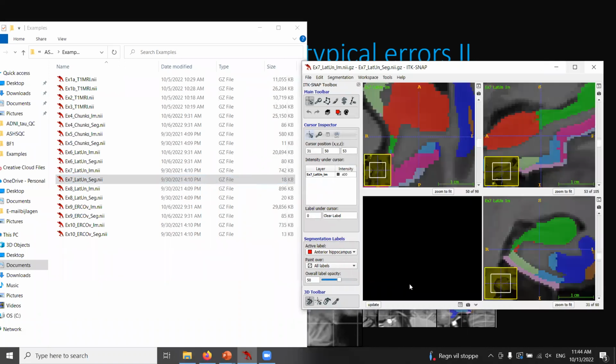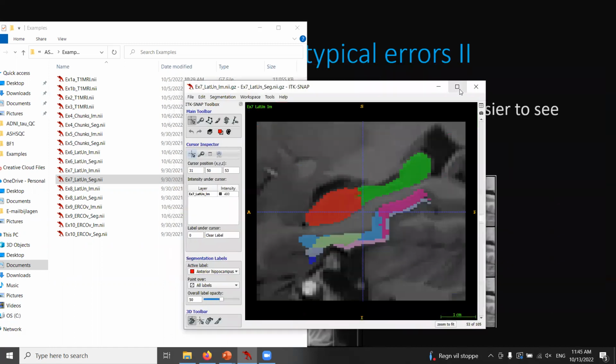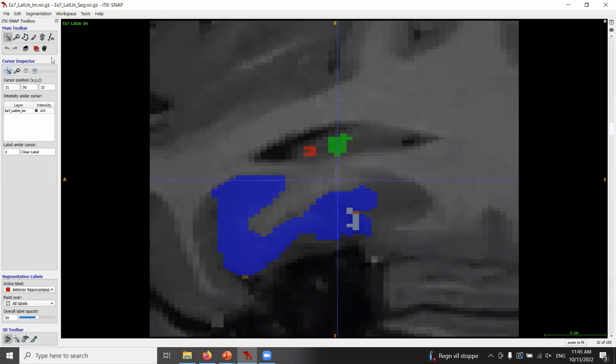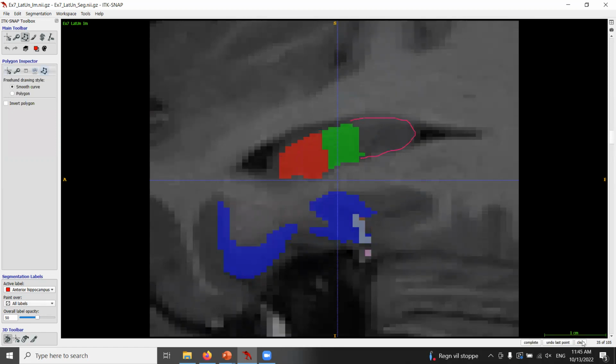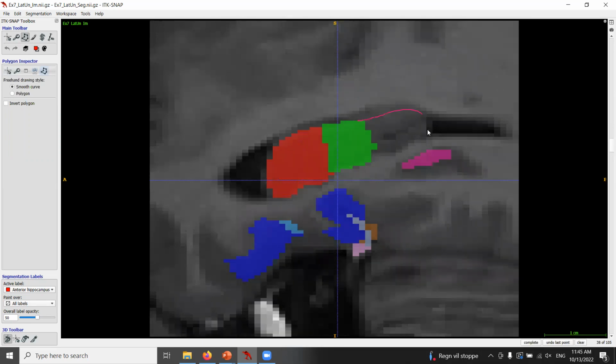And I actually wanted to show you the 3D first. So here it's a bit easier to see in the 3D, where you can really see there's a bite kind of taken out of the hippocampus. So let's check that out in the sagittal plane, but you can kind of see this should all have been segmented. This should be segmented and so on. So that's again quite a large chunk that is taken out of it.